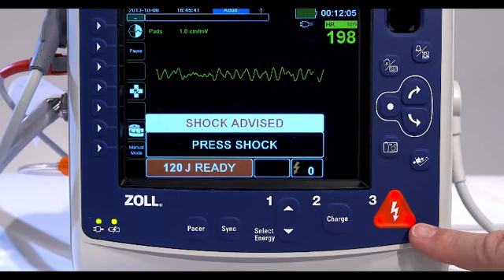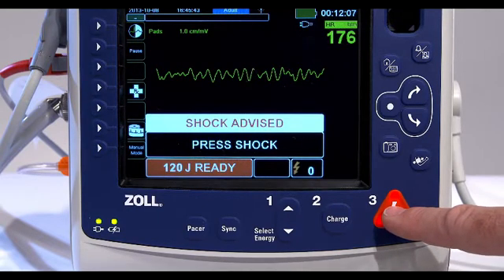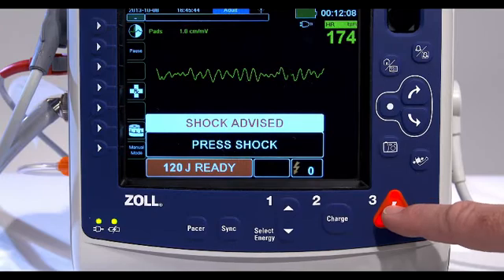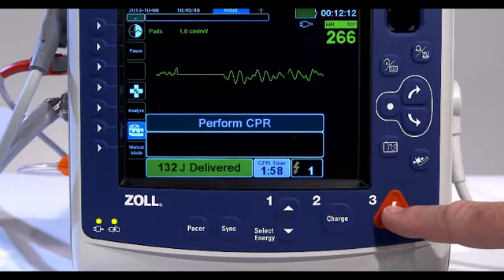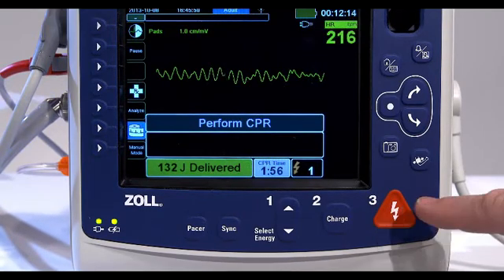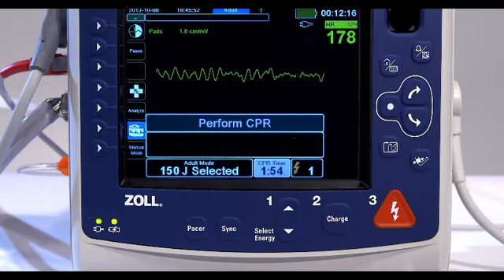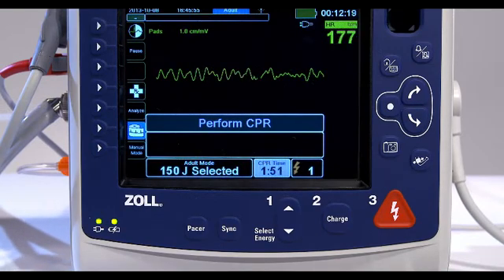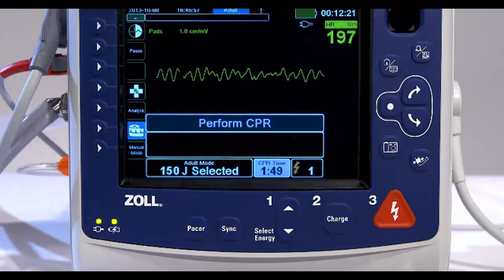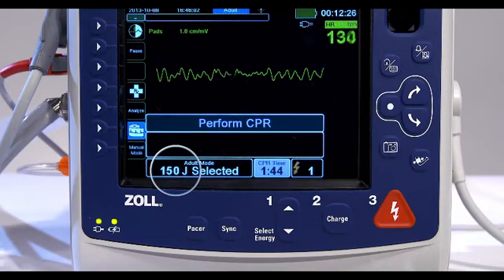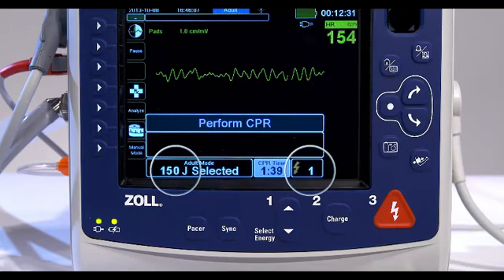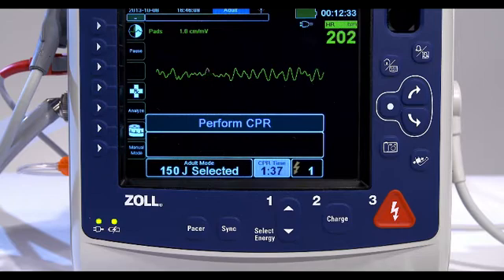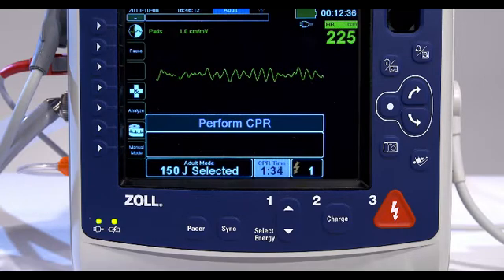You must deliver the shock within this 30 or 60 second interval, depending on configuration, or the defibrillator will disarm itself. Press and hold the illuminated Shock button on the front panel until energy is delivered to the patient. Observe the patient or ECG response to verify that the shock has been delivered. The delivered energy level and the shock number are displayed in the panel at the bottom of the screen. Immediately begin chest compressions and continue other treatment per protocol.